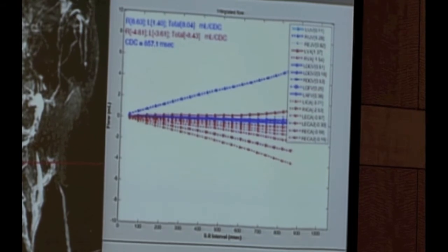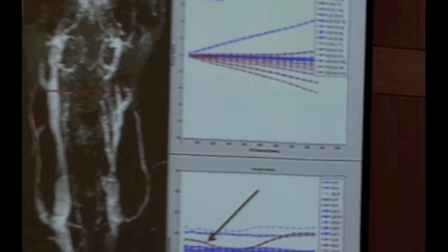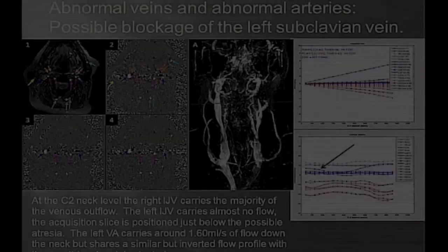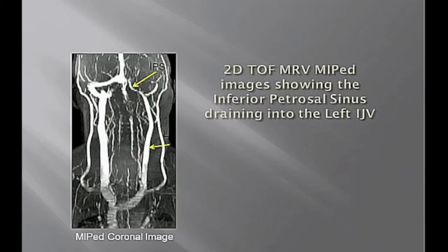Now, for the interventional radiologist, of course, you also have the complete 3D structure, so you can get an idea of what you're going to be looking at before you go in there. Because you're going in, you're injecting, you're looking at one side at a time. Here you have the information available to you ahead of time for preoperative planning.